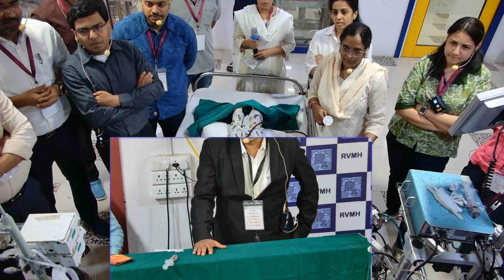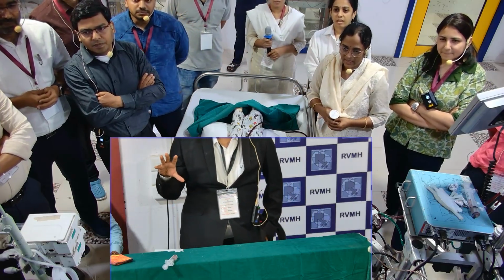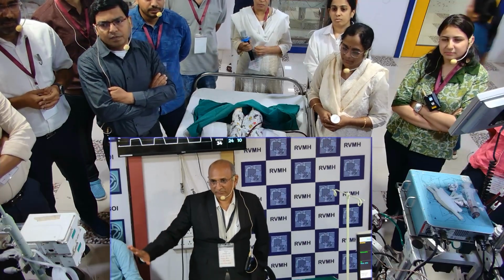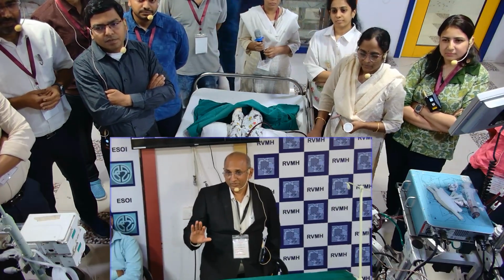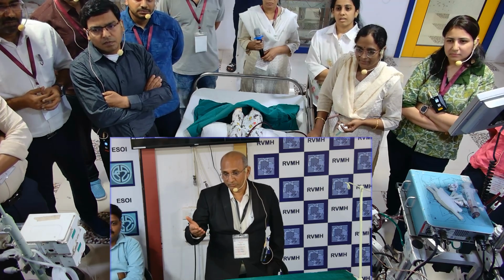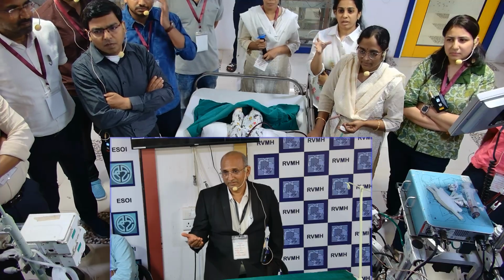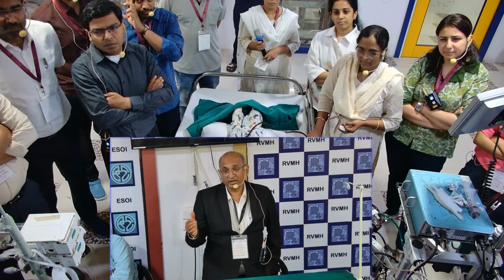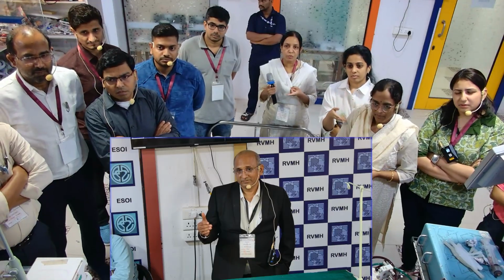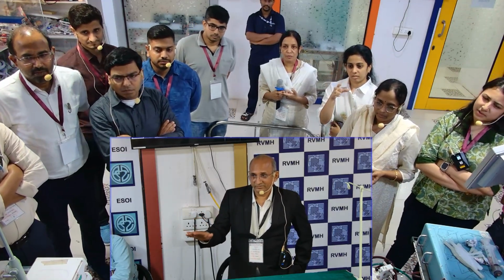Both the tube colors become the same. That also you diagnosed fast. Both the tube colors are dark red. That means there is something wrong with the sweep gas failure, isn't it? There is no other differential diagnosis for both the tube colors becoming the same color? None, sir. Bright red? Both are dark red. Misconnection in VA ECMO? No, both are dark red.